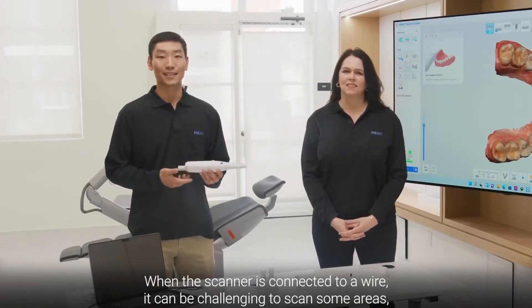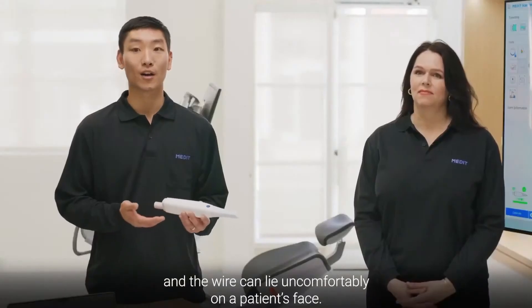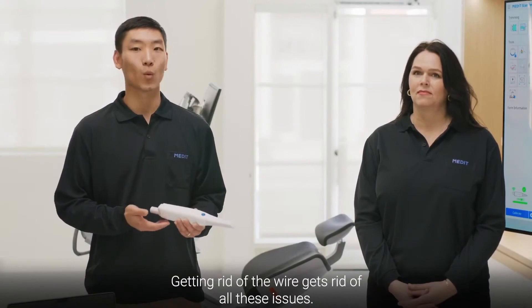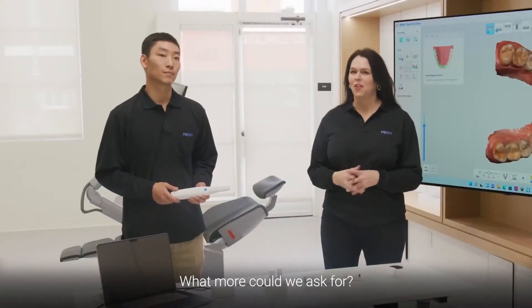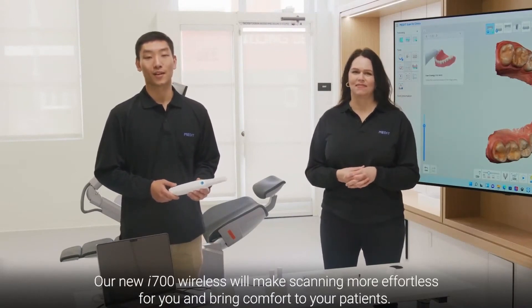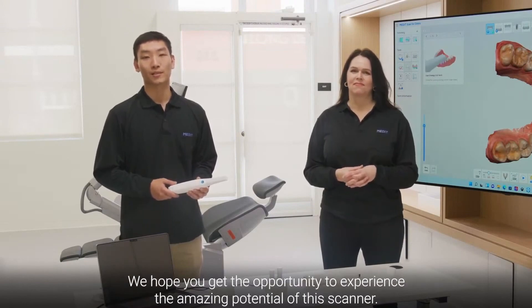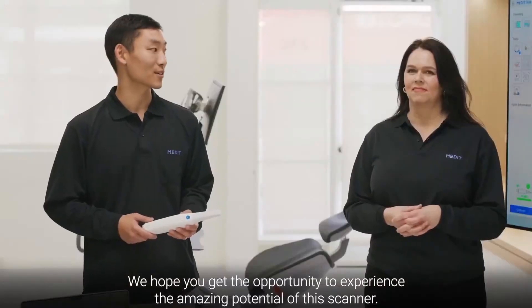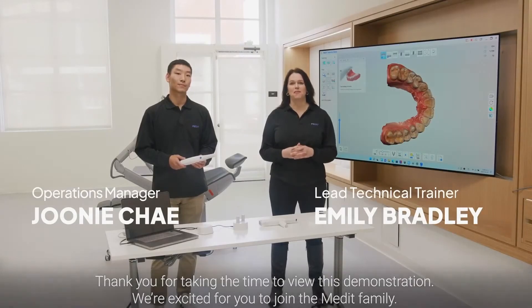When the scanner is connected to a wire, it can be challenging to scan some areas, and the wire can lie uncomfortably on a patient's face. Getting rid of the wire gets rid of all these issues — magic made it easy with a simple touch. Our new i700 Wireless will make scanning more effortless for you and bring comfort to your patients. We hope you get the opportunity to experience the amazing potential of this scanner. Thank you for viewing this demonstration — we're excited for you to join the Medit family.